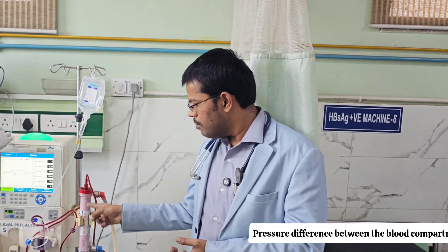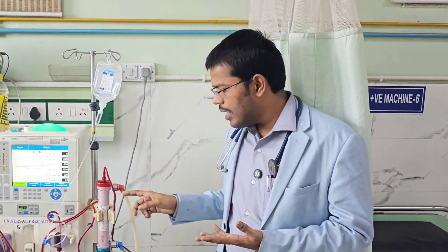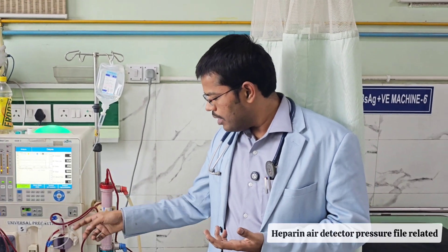The transmembrane pressure (TMP) is the pressure difference between the blood compartment and the dialysate compartment. If TMP goes above or below a particular limit, the alarm starts ringing — this is the transmembrane pressure alarm. Additionally, there is an air detector alarm in the blood circuit. So overall, the blood circuit has five alarms: blood pump, heparin pump, pressure, air detector, and transmembrane pressure.